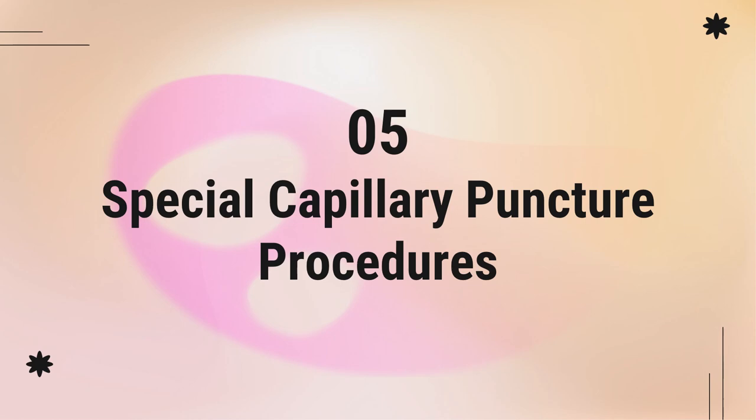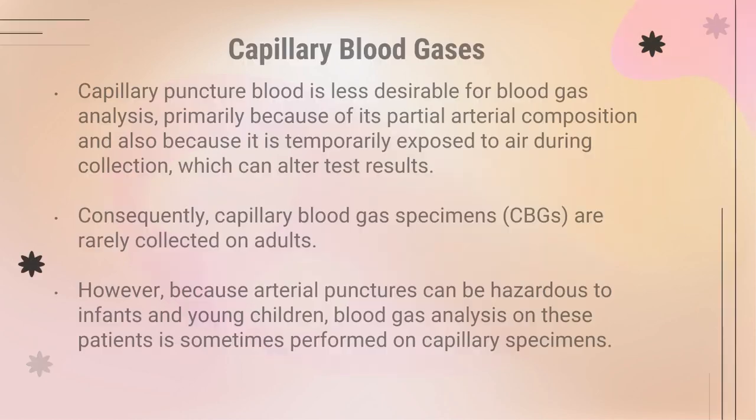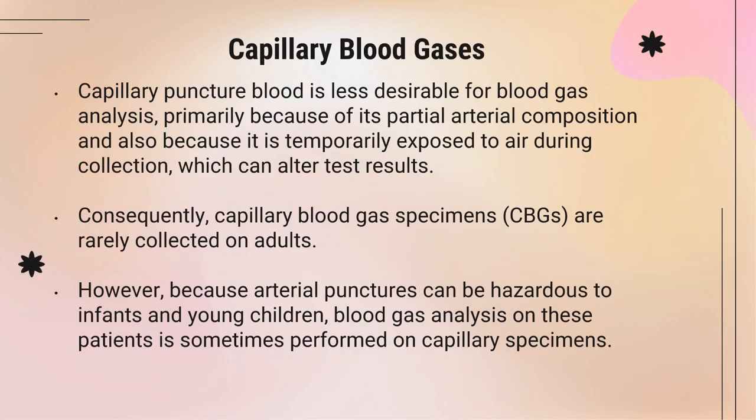Now we go to the special capillary puncture procedures. The first special capillary procedure is for capillary blood gases. Capillary puncture blood is less desirable for blood gas analysis, primarily because of its partial arterial composition and also because it is temporarily exposed to air during collection. This can alter the test results.